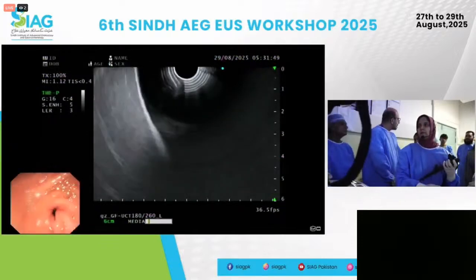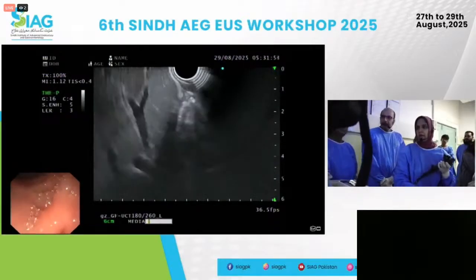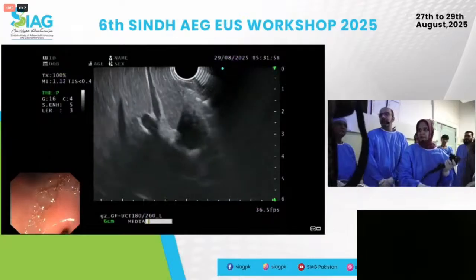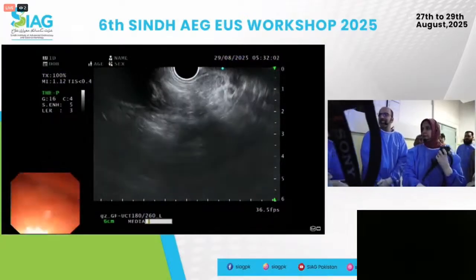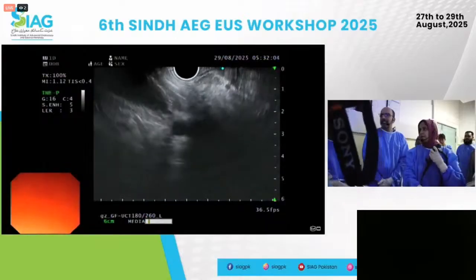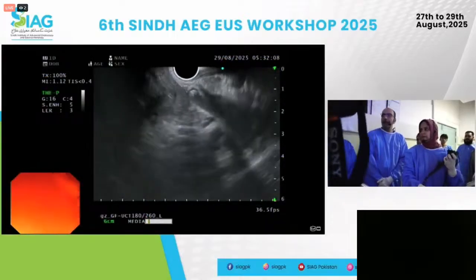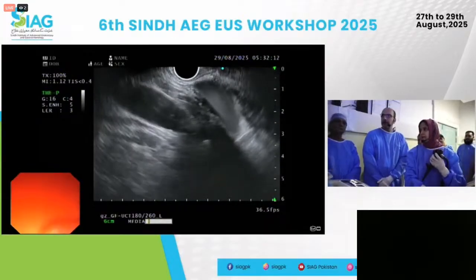So what is the purpose of this exam? Just for evaluation of pancreatitis? One of the questions here would be whether or not to biopsy. Yes, the purpose of this particular case was that we are seeing more and more patients being treated as autoimmune pancreatitis with no EUS examination, with just an elevated IgG4.